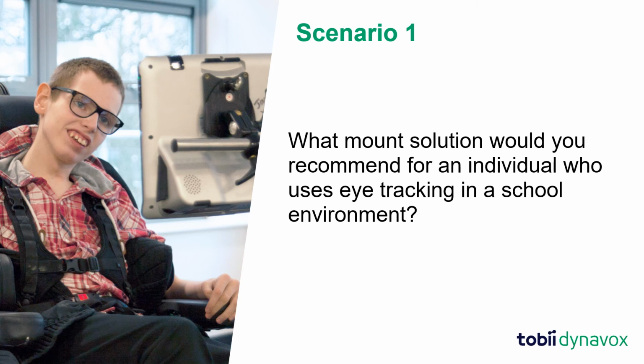If the child lays down for part of the day and uses their device, they may need a floor mount. If the child varies their position throughout the day, a floor mount may be the best option to accommodate this range of positions.